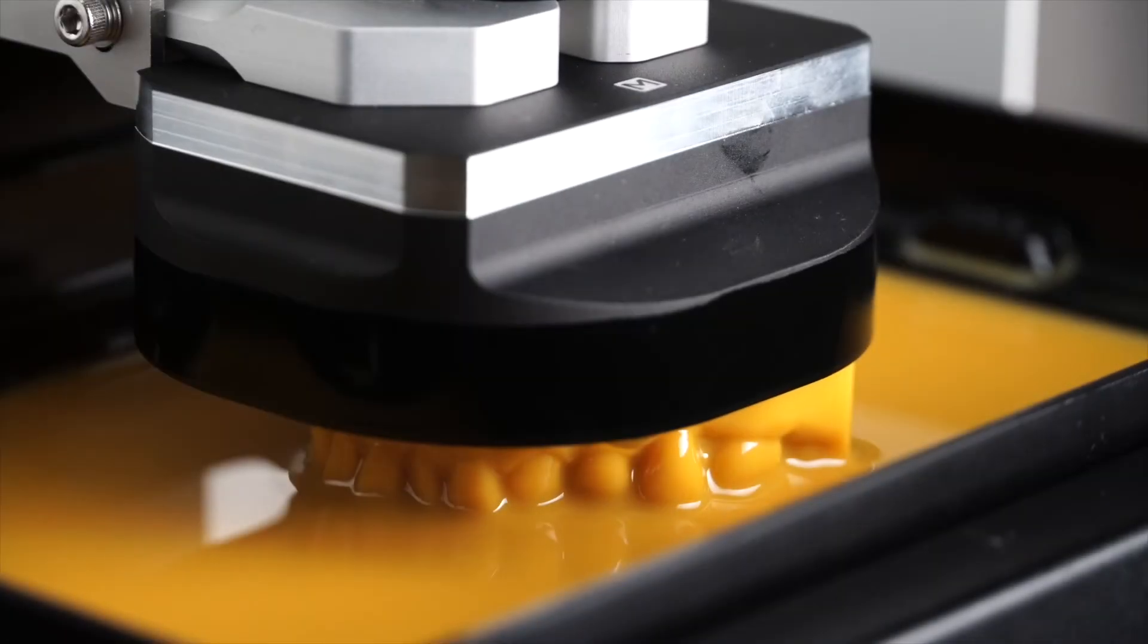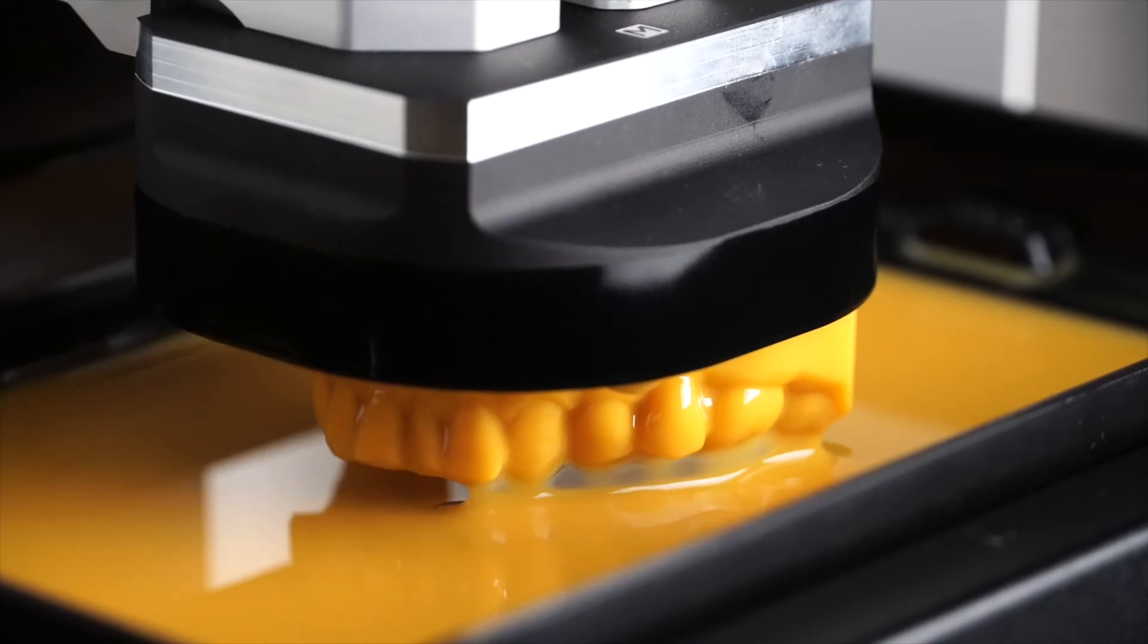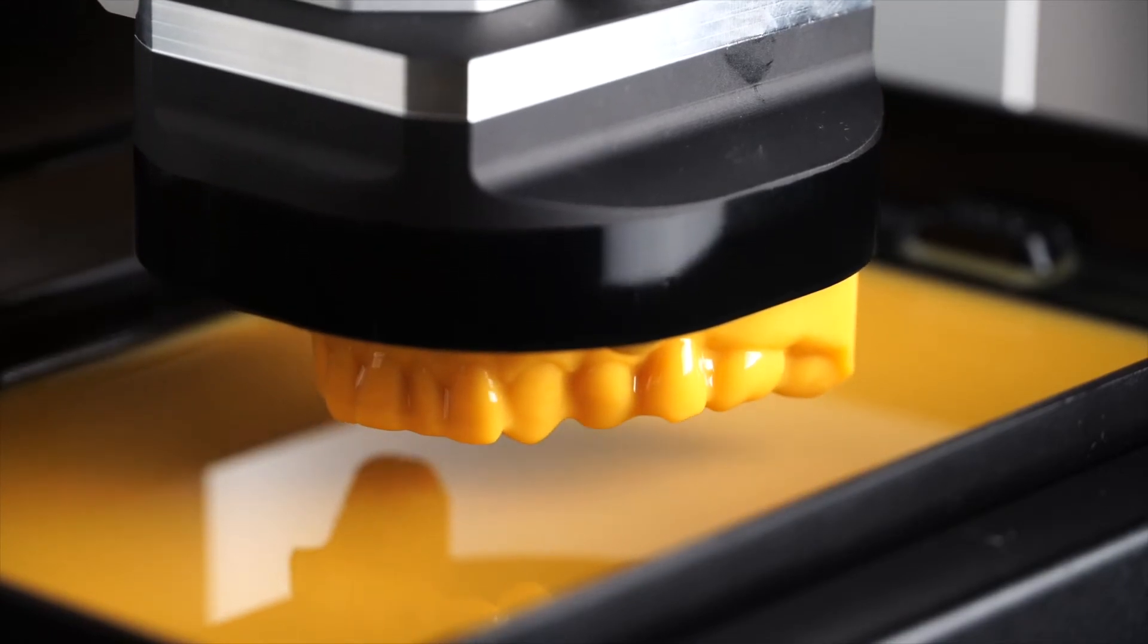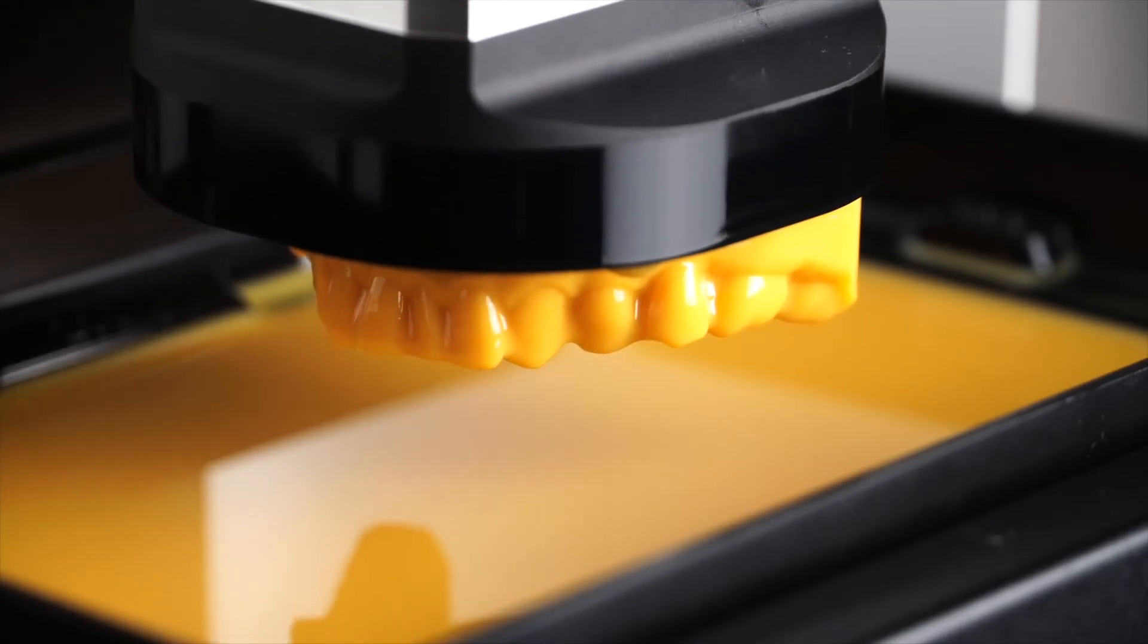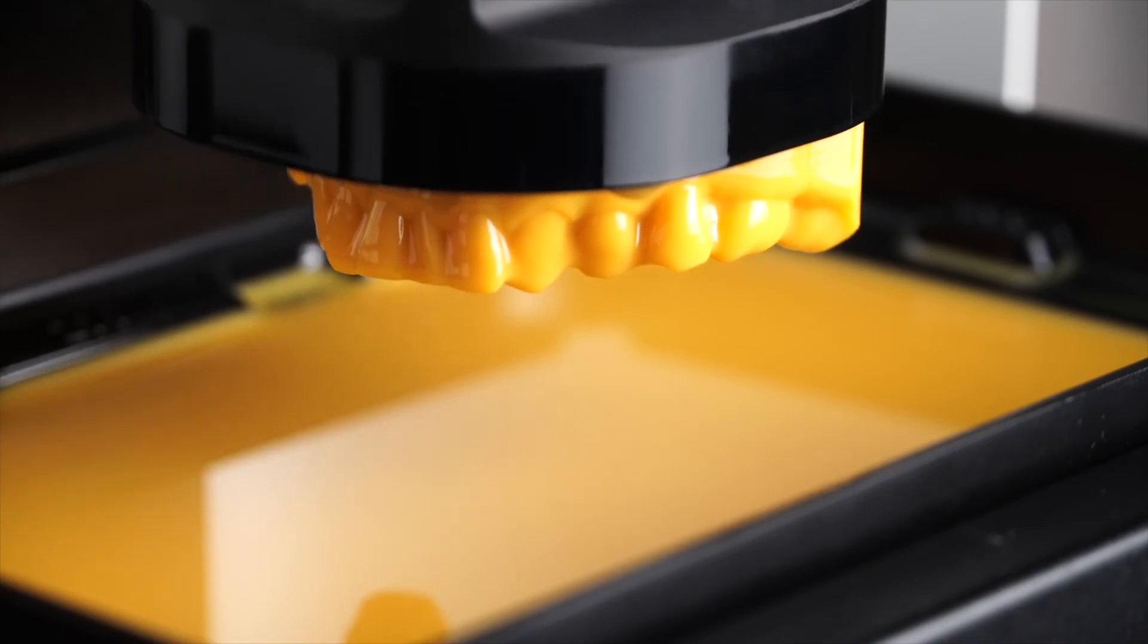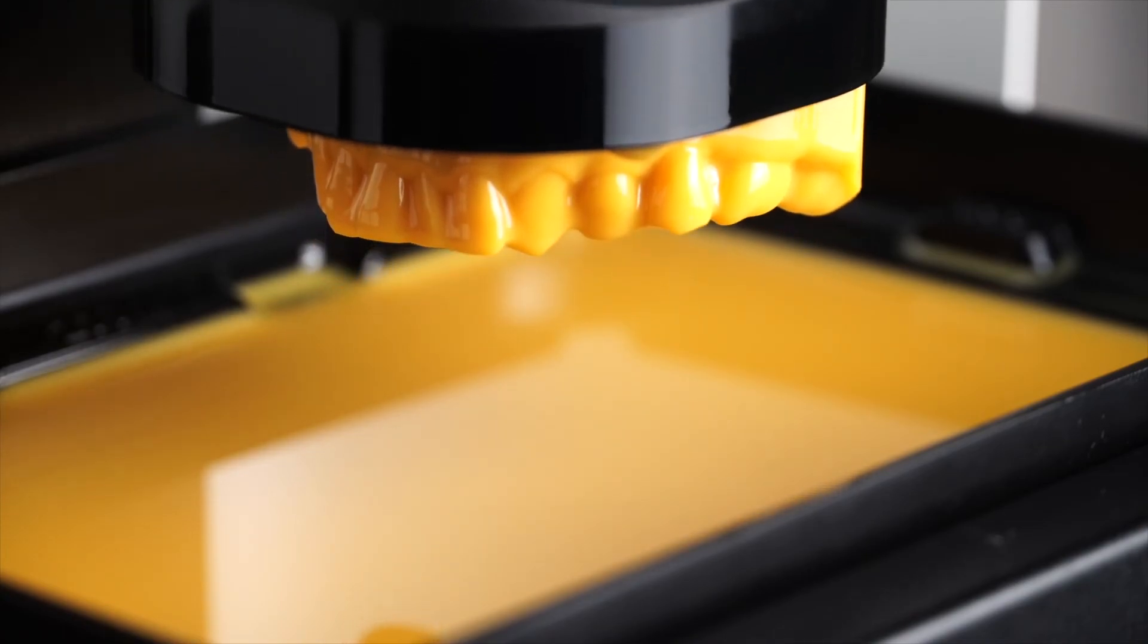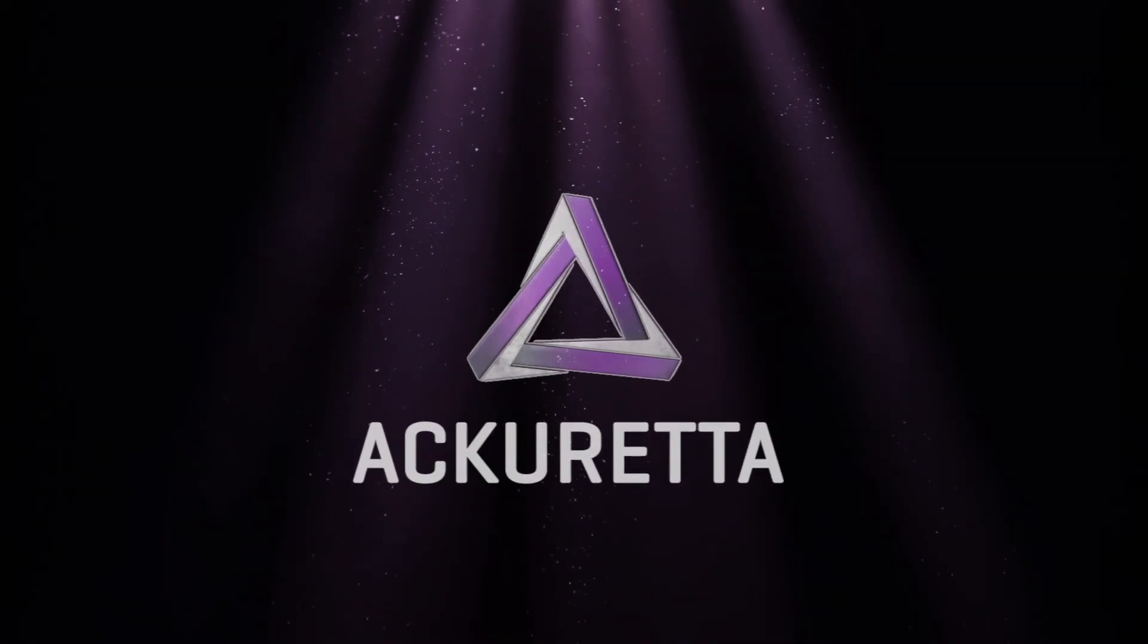After 29 minutes, our full arch model is finished printing at 100 micron layer thickness, which is 35% faster than with the standard build platform at the same layer thickness.